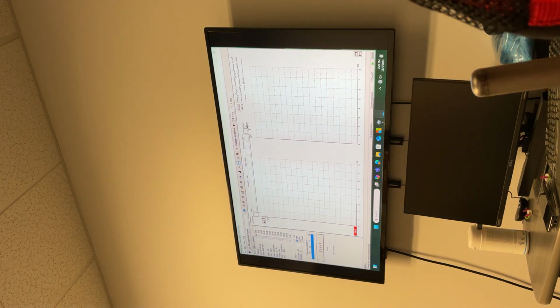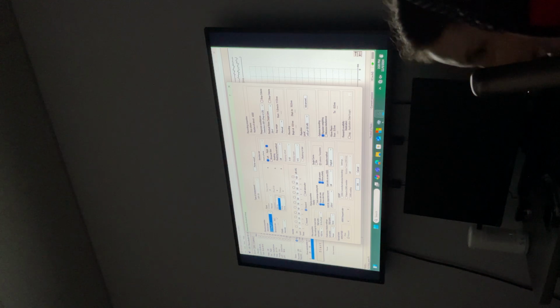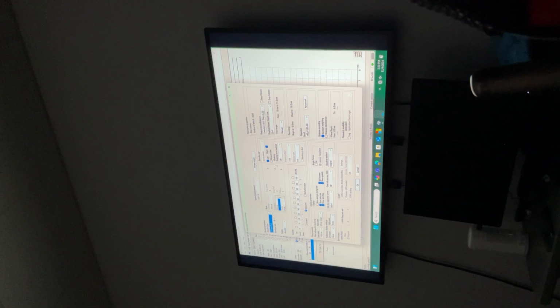So we're gonna start with the broadband chirp. Just take them all. So the default rate is 39.1, you can stick to that. Want to sit down here? 39.1. Yeah. So you can measure from 30 to 1500, or in the lab document I say 2000. Okay. So this is broadband, 39.1. Alternating polarity. What else? That's it.